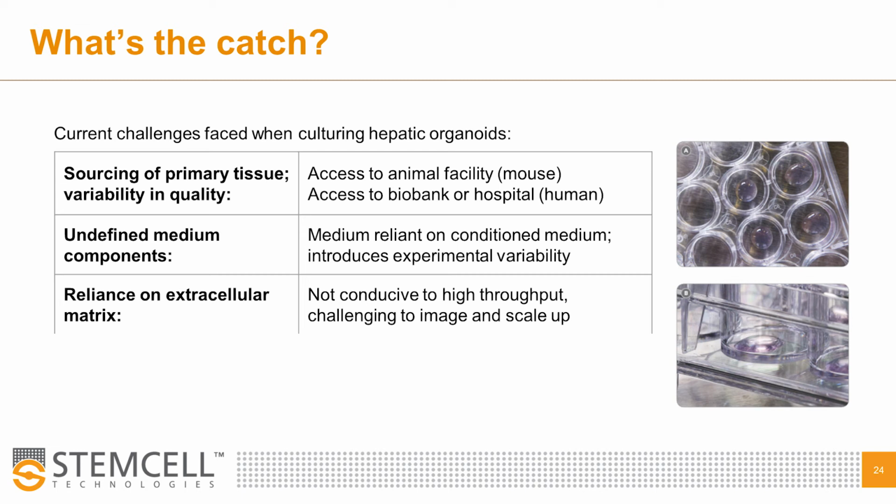And also, speaking of matrices in general, they are currently not conducive to high throughput methods and scale up. In order to address these challenges, for example, we have introduced the use of the suspension culture system, and I will go into that in more detail in my last slides. And as a final note on matrices, when it comes to objects growing in 3 dimensions and in different planes, there's also an additional complexity that is added when it comes to imaging these objects.